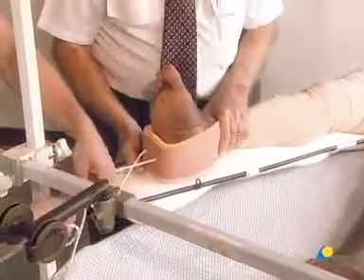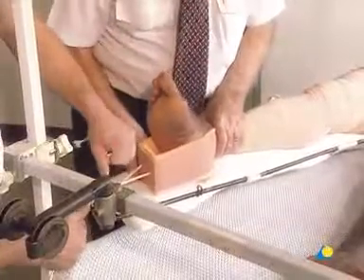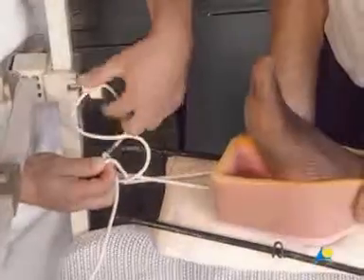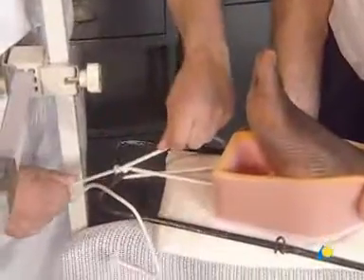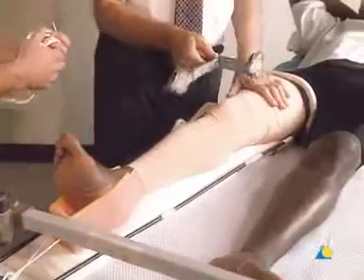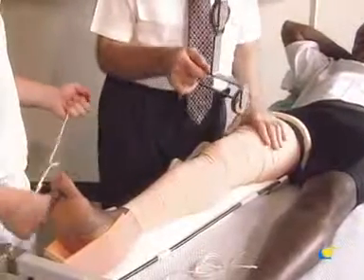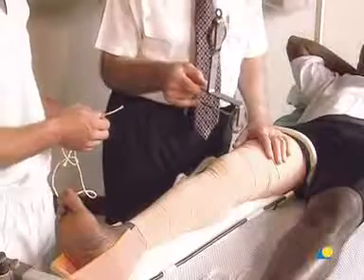Traction is applied to the fractured femur by tying the cord attached to the end of the elastoplast to the distal end of the Thomas splint. The T-pulley does not exert traction. Instead, it suspends the patient's leg to allow the patient to use a bedpan and to be bathed.